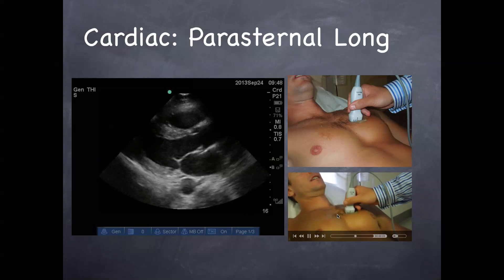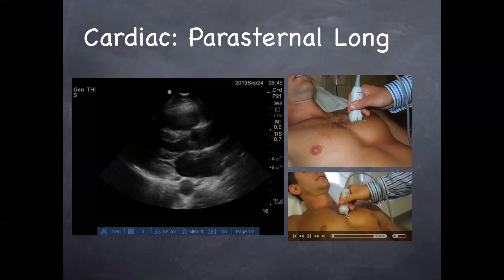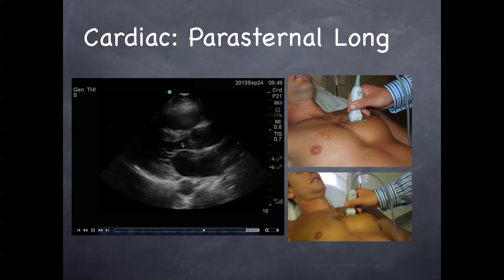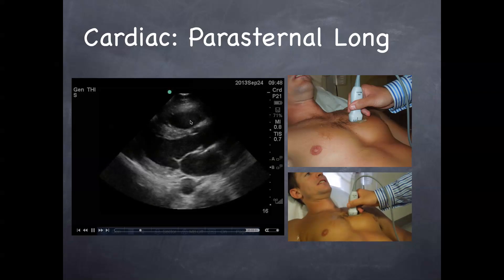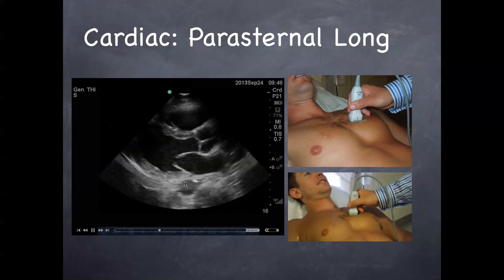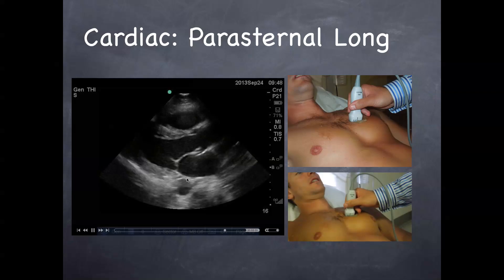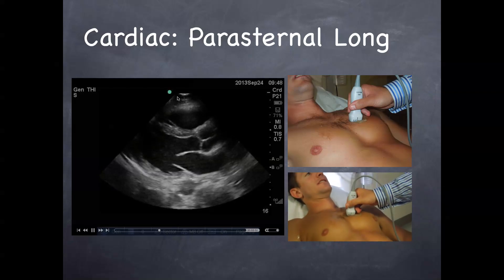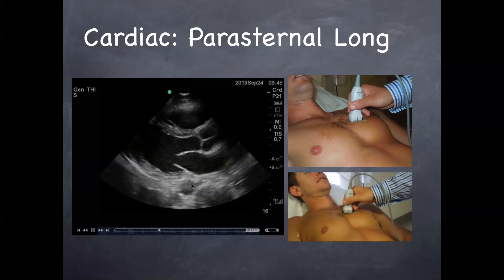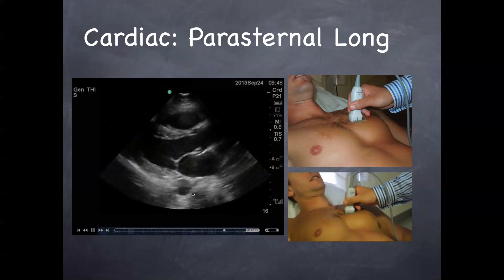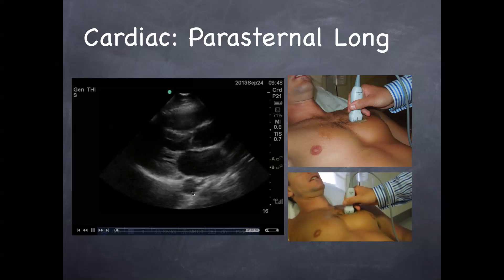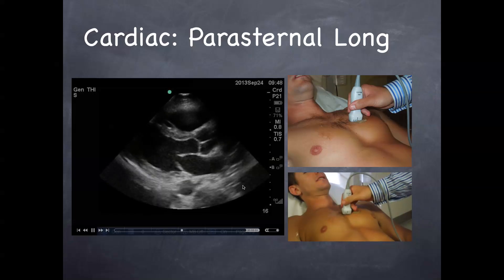Moving from the center of the body, right on the sternum, and then just move a little laterally to the left to gain this image. As you can see here: left atrium, left ventricle, outflow tract, nice aortic view, and here again is your right ventricle, which is closest to the probe. This structure here is the descending thoracic aorta — the aorta wraps around, comes off the heart, and then wraps around and comes downward towards the abdomen. It's the landmark to differentiate between pleural or thoracic and pericardial effusions.